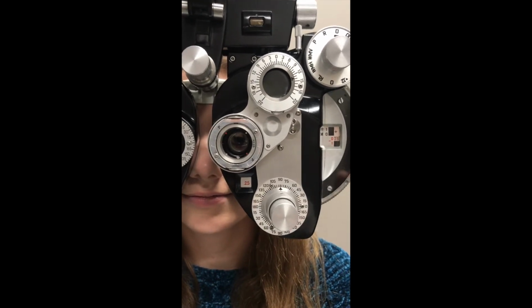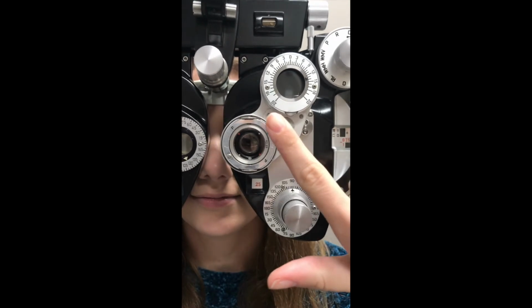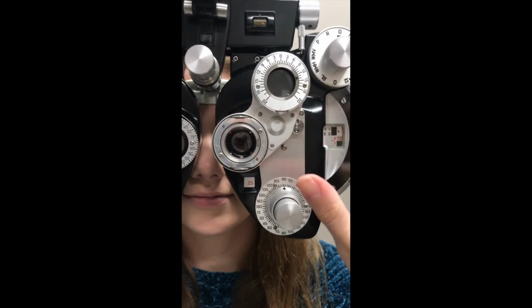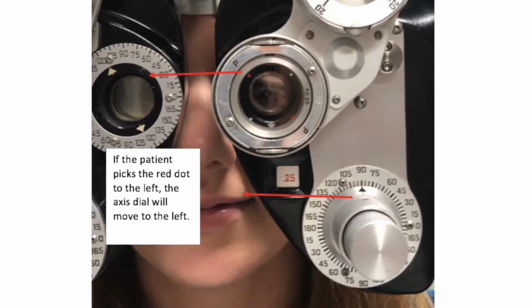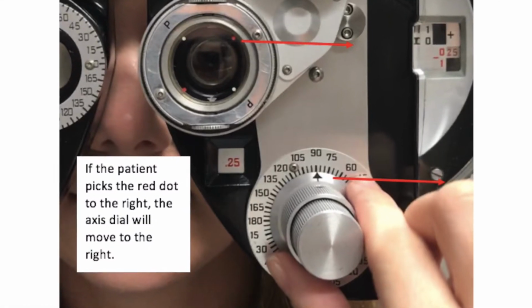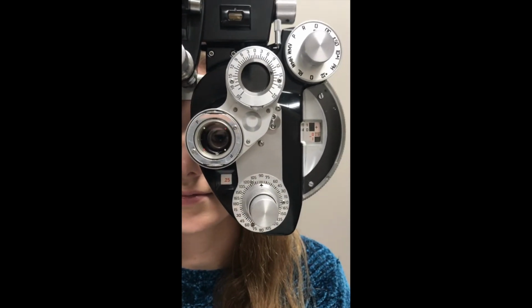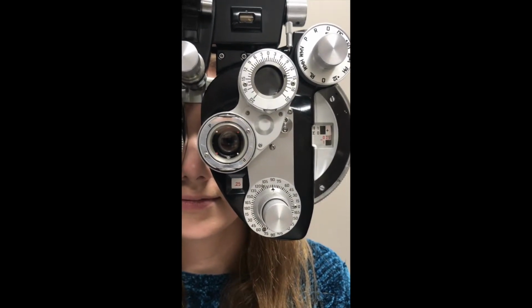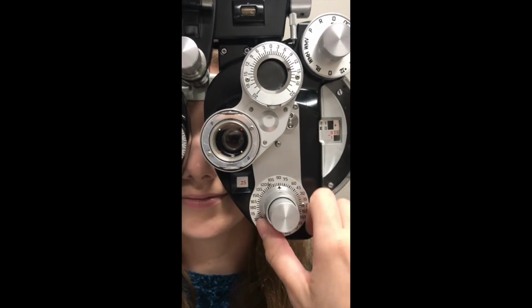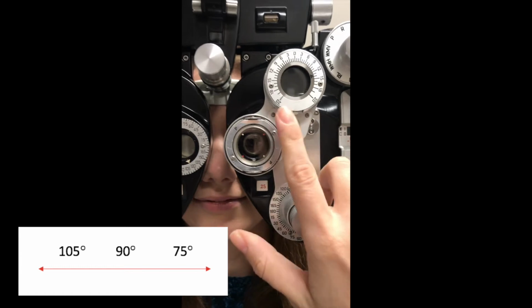Now for this step, it's important to just look at the top half of the JCC at the red dot at the top. And as she prefers, option 1 of red dot going that way or red dot going to the right, that is the way that we'll move our arrow in different increments as we narrow it down to the final axis degree. Okay, so let's start here. Abigail will rotate 15 degrees after we ask her.